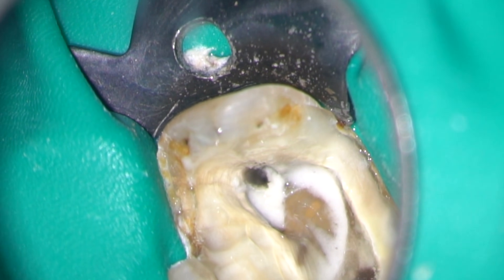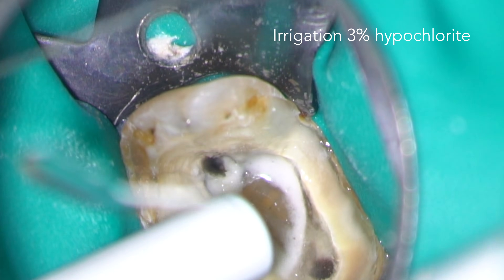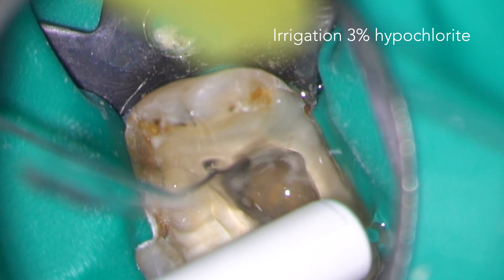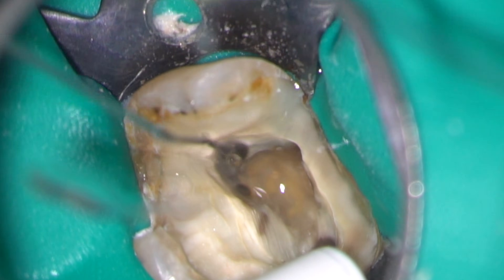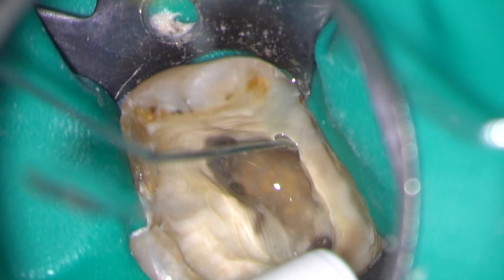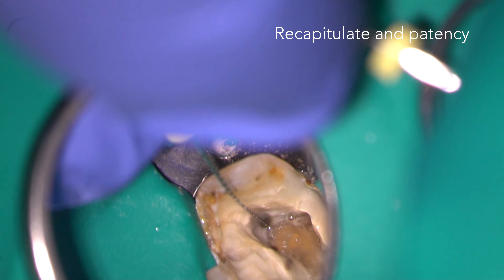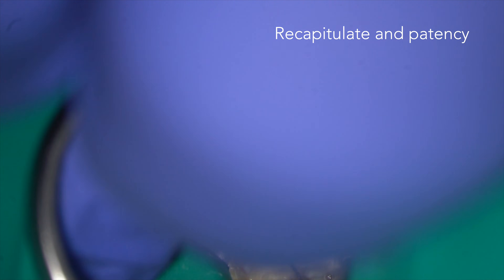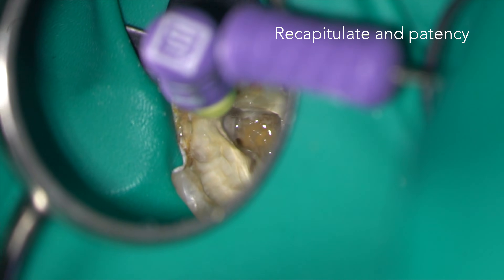You can see how much dentine debris is created by the reciprocating file, and this needs to be removed frequently with irrigant — in this case 3% sodium hypochlorite. Between irrigation sequences, I recapitulate with a hand file to confirm patency and make sure any dentine chips that remain in the canal are distributed within the irrigant.